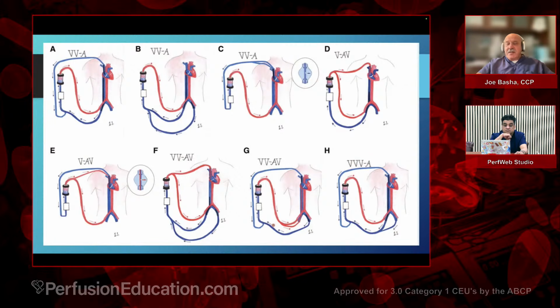So you could, in theory, put your ECMO flow probe here to measure your venous access flow just to have it. But your return, you want 2 probes, 1 here and 1 here, so that you know which of these you're flowing to and how much.